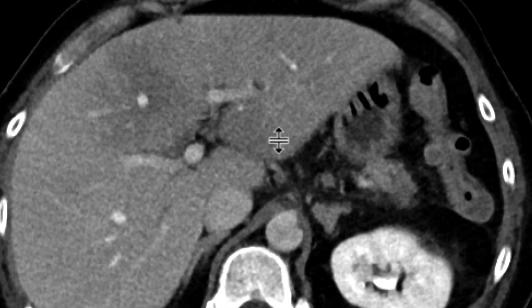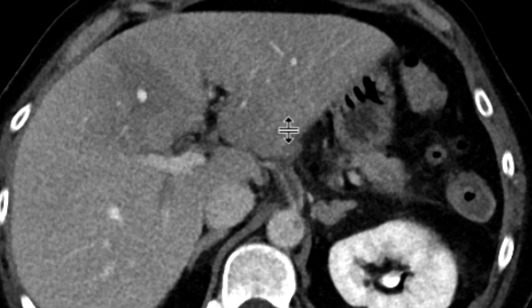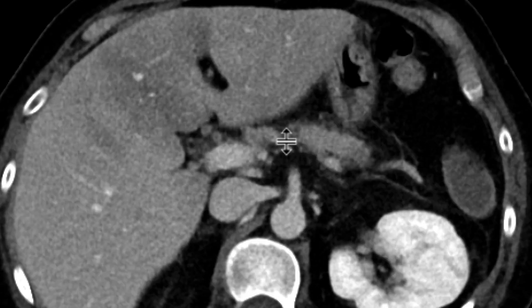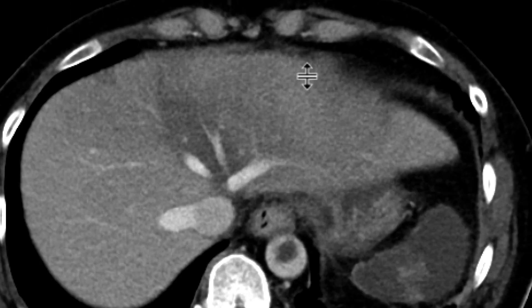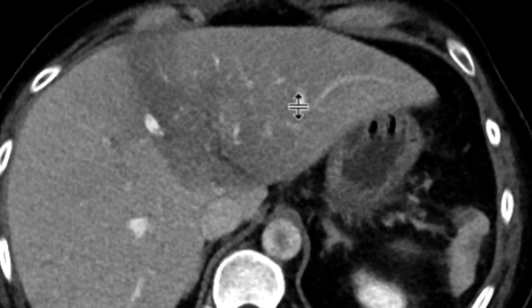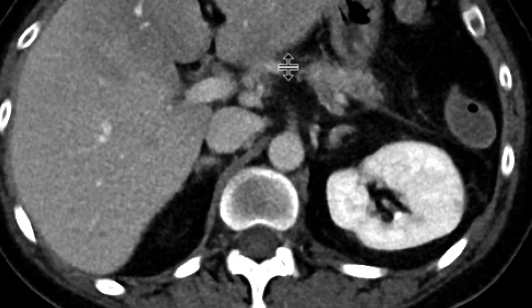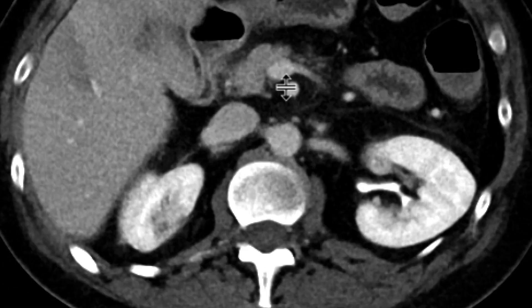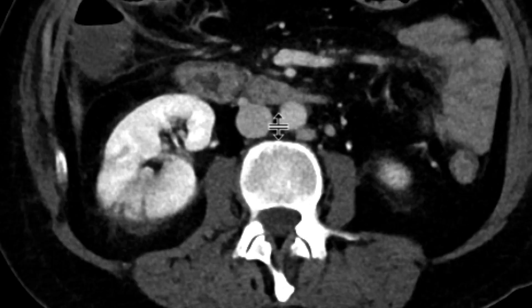There are areas of heterogeneity particularly in the left hepatic lobe, and that could potentially be focal fatty infiltration. At this point it's tough to know if that's going to be anything more than that, but we'll get back to that in a bit. The kidneys also don't look too happy.